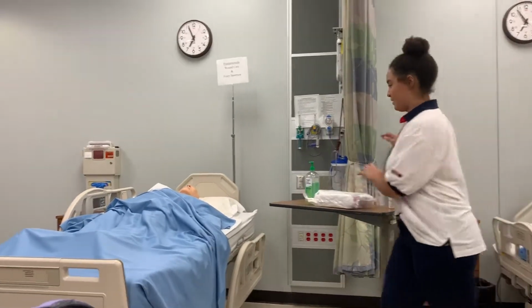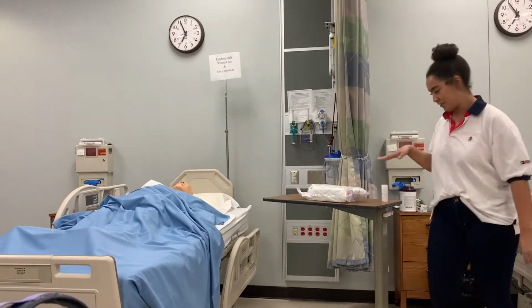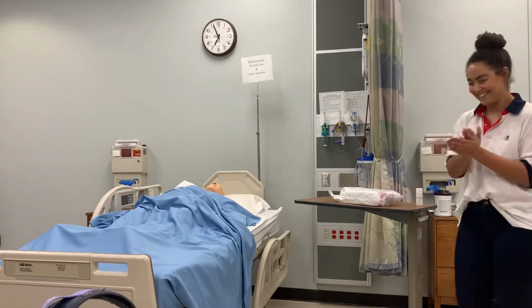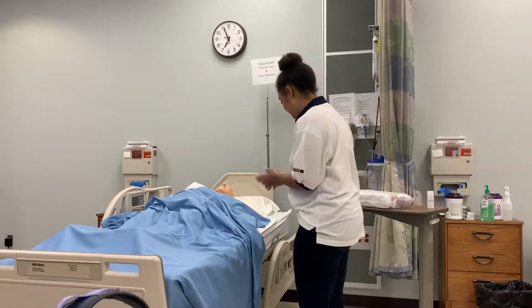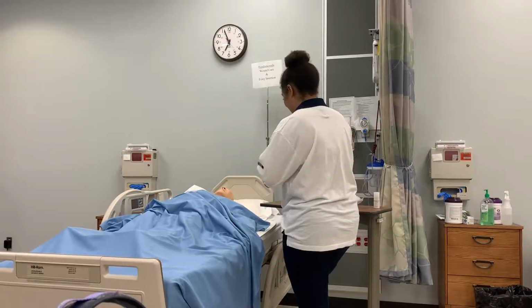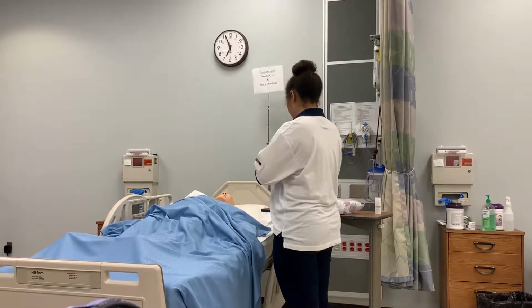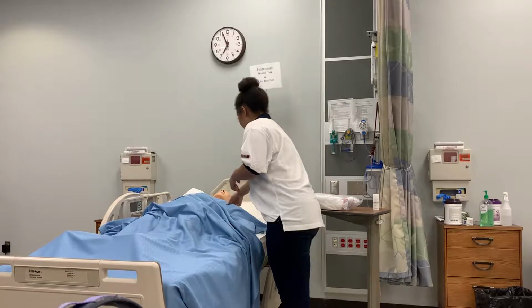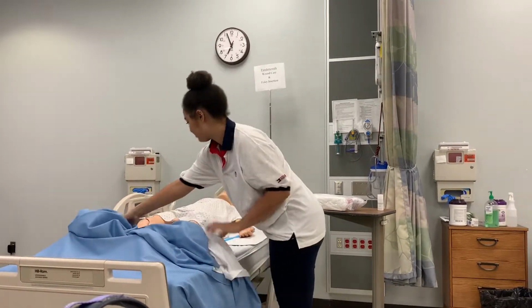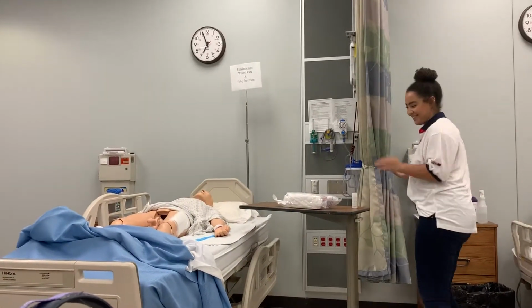Okay, so I have my sterile workstation here, and I have my sterile kit, and I am performing hand hygiene. All right, so I lowered this bed rail for it to be moved out of my way, and I raised everything to the appropriate height. And so now I am going to uncover Mr. Fundamental. Okay, I'm going to perform hand hygiene again since I touched him.